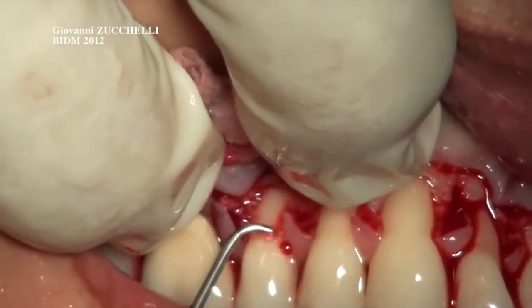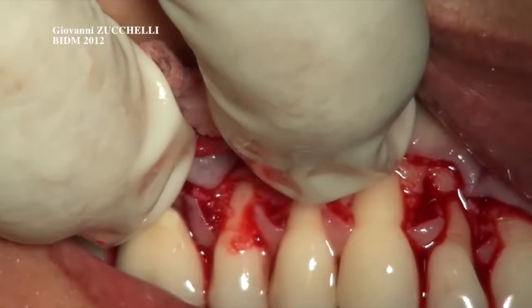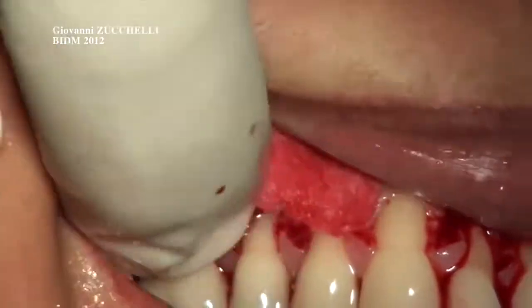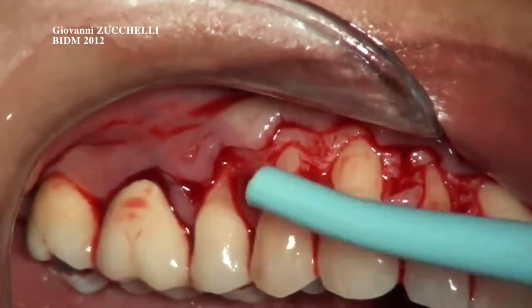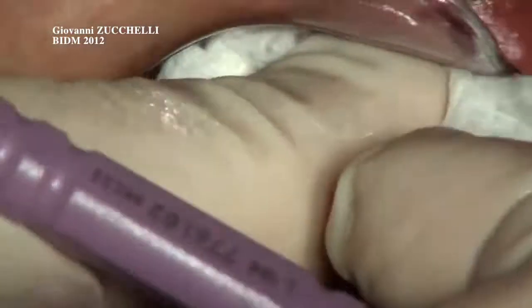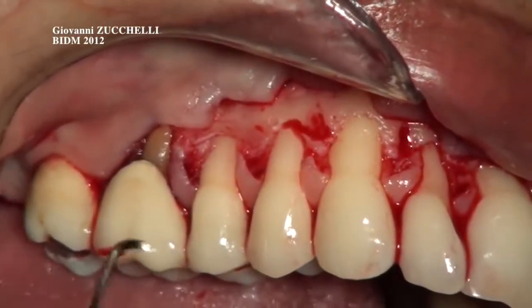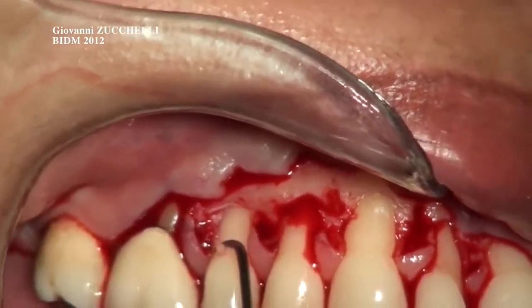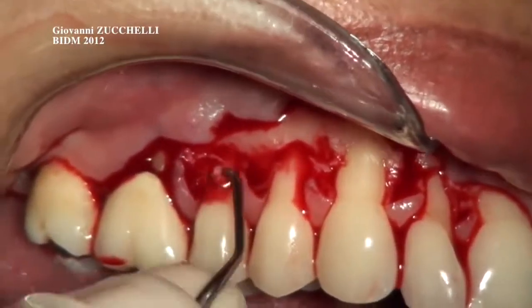Even this root was really very, very soft, because maybe this gingival recession has existed for many, many years. Sometimes an indication or not to make root coverage surgery is the depth of the gingival recession. And this is something that I don't approve at all, for 2 reasons. The main reason for a worsening of gingival recession is not really the depth of the recession, but the amount of keratinized tissue remaining apical to the gingival recession.